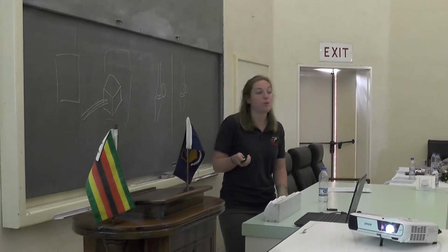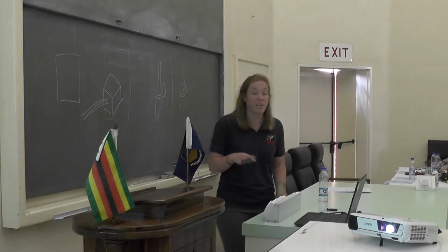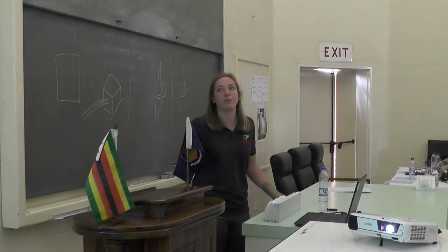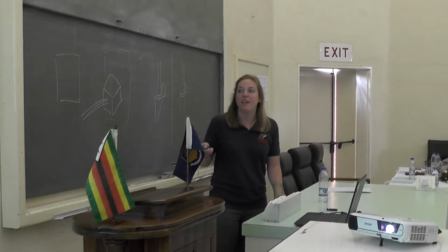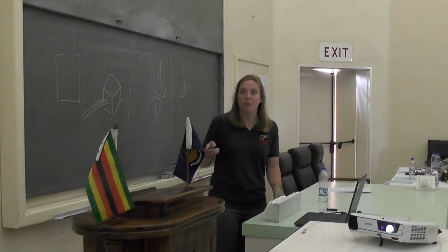And then the other 2 that you should always do as a basic routine examination of any structure of the distal limb would be the other 2 that we've already spoken about. So the dorsal lateral palmar medial oblique and the dorsal medial palmar lateral oblique. So the DLPMO and the DMPLO. And you can see here they essentially go in between the dorsal and the lateral for the DLPMO and land exactly the opposite way. And this one starts in between.